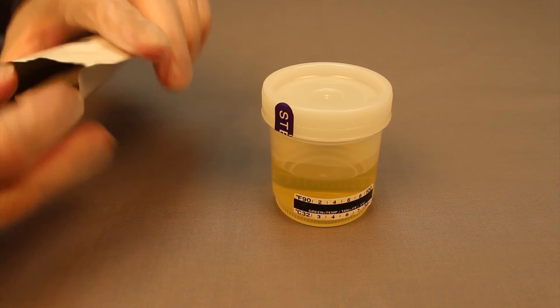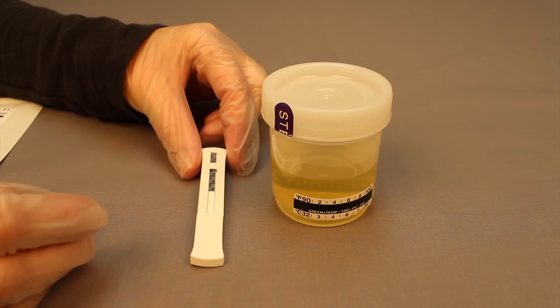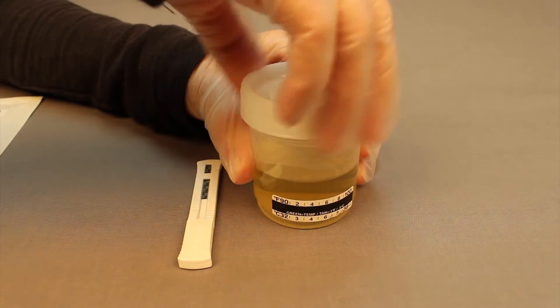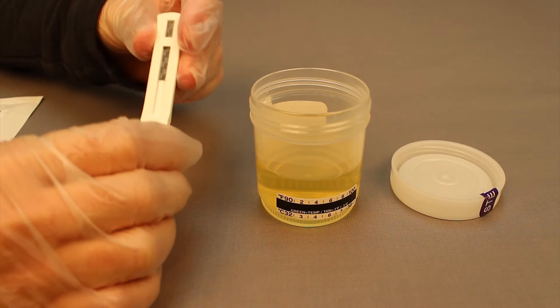Remove the device from the sealed pouch. Then remove the cap to expose the sampling tip.